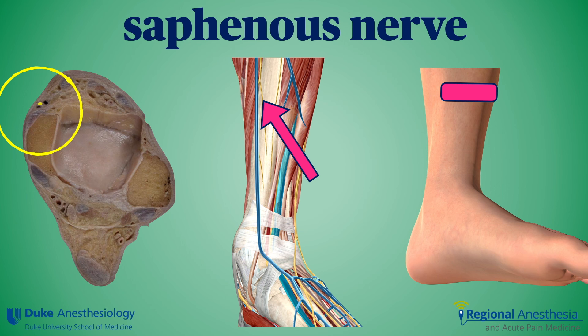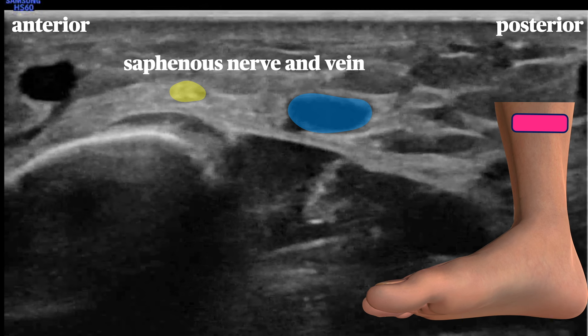The saphenous nerve is another one that's easily blocked by subcutaneous field block just above the medial malleolus. With the ultrasound technique, the saphenous vein is found and local anesthetic placed immediately adjacent to it. This nerve is the least visible of the five because it's just so small at this point, but the vein provides a good landmark.